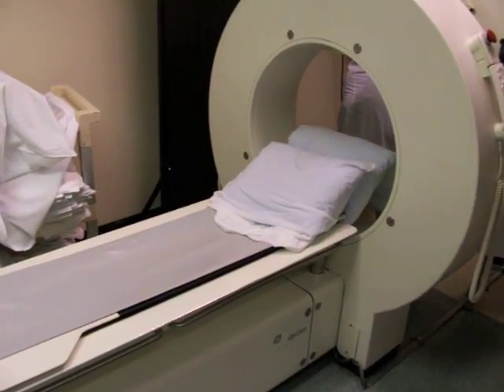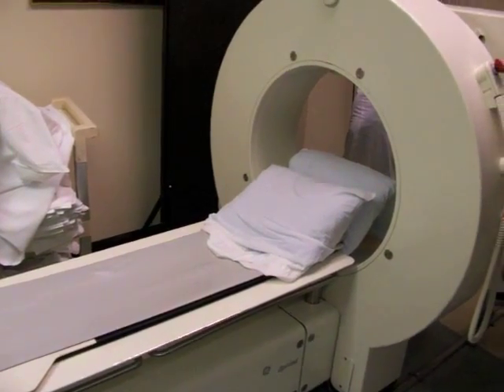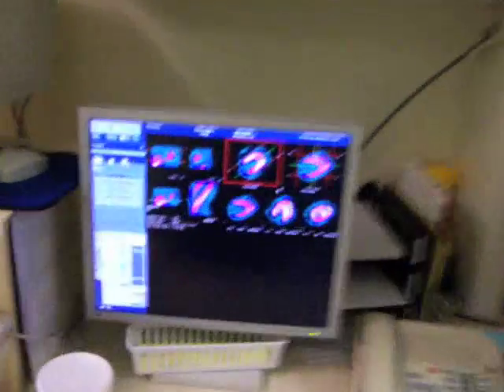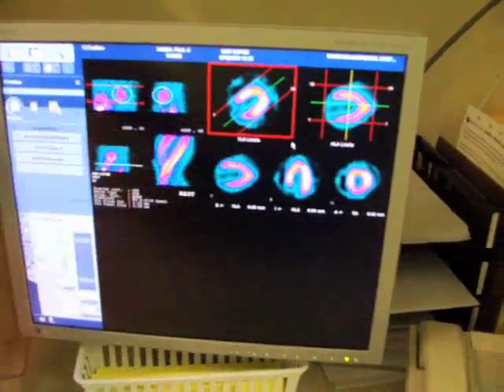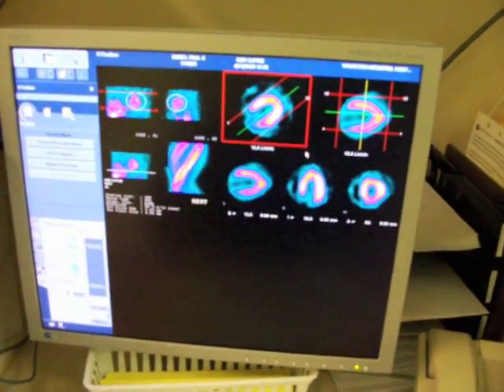And after that, we're going to go to the cardiovascular department, and he's going to run on the treadmill a little bit, get the heart rate up, and we'll give him the injection of the tracer again and do the imaging again just to see if there's any differences in the blood flow to your heart. They're doing this because the EKG was a little abnormal, but they want to make sure everything's okay for surgery. So those are the images right there, the first set. And we're just looking for the blood flow to the heart. This is the baseline one, and the stress images, we'll compare those to these ones and just see if there's any differences or changes based on when you're exercising as compared to when you're resting.